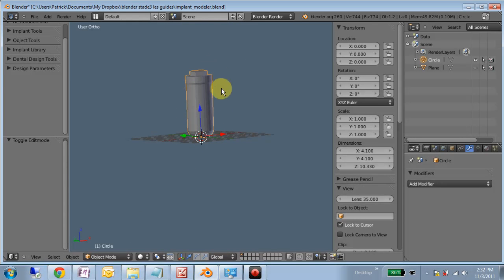So I'm going to stop here because that's enough for now. And I know I moved through that very quickly, but you have the screencast, and you can definitely pause, and I'll try to add some annotations as well to help with following along.